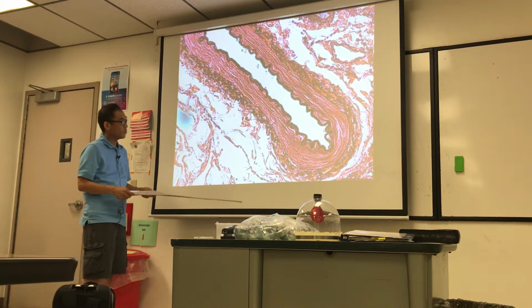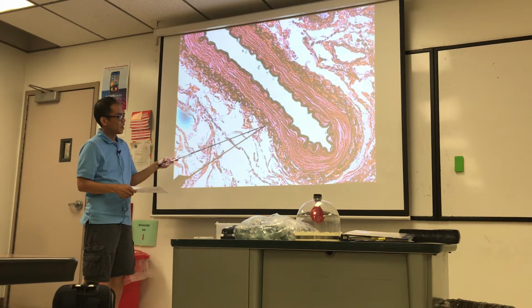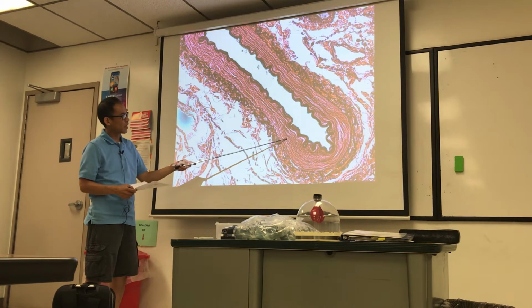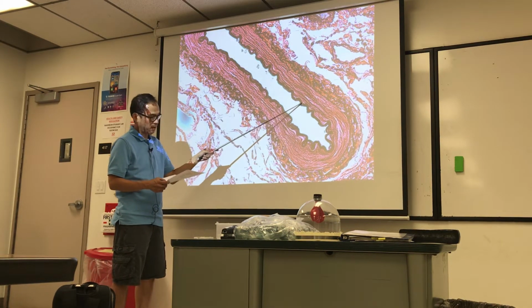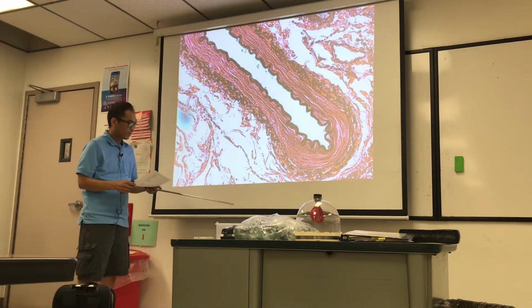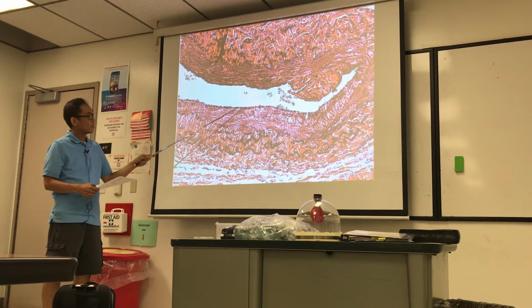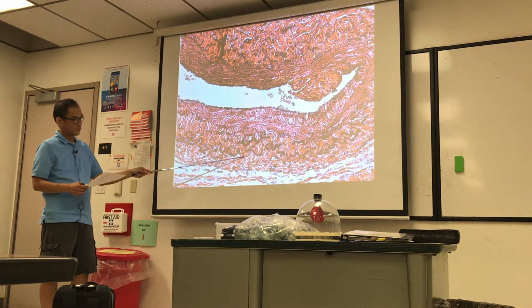If we look at the artery, the tunics are TI, TM, from here to here, TA. It's a muscular artery because there's elastic tissue in there, but the pink is more than the black. There's more smooth muscle proportionally. The black looks like elastic waistband in here. That's internal elastic lamina for the muscular artery. For the tunica media, you may be asked to identify the smooth muscle or the elastic fibers. And for the vein, the tunics are tunica intima, tunica media, and tunica adventitia.